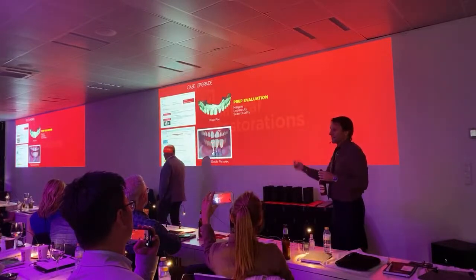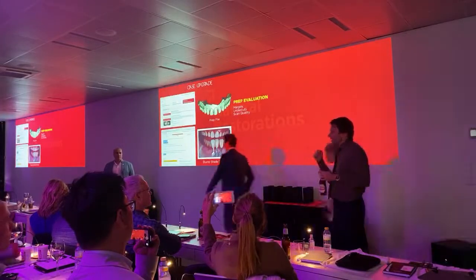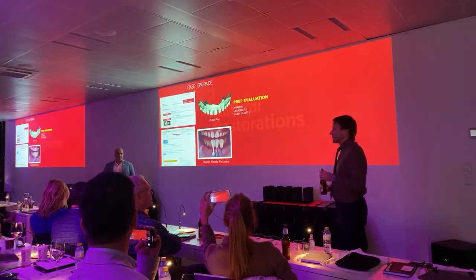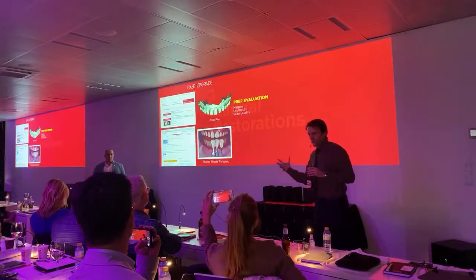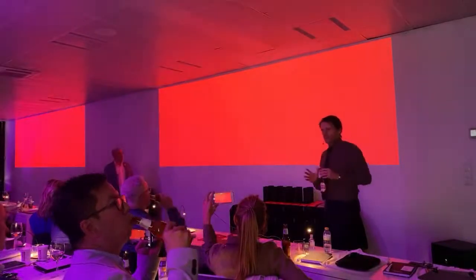Unfortunately, we don't have the technology yet to have something that you can fit in the mouth and do a computer-guided preparation. We will get there, but we are not there. So what we need to do is what we call partially guided preparation. We need to use technology to allow us some guides that will minimize the mistakes.